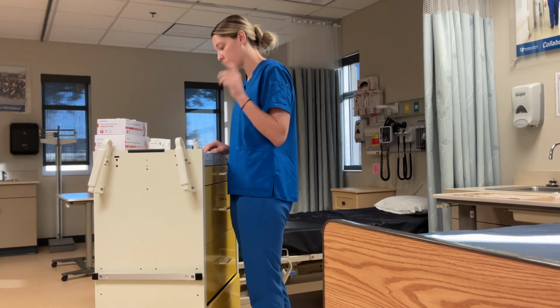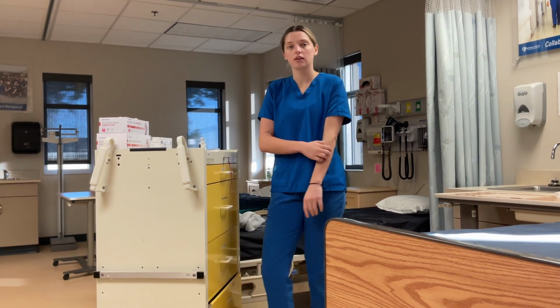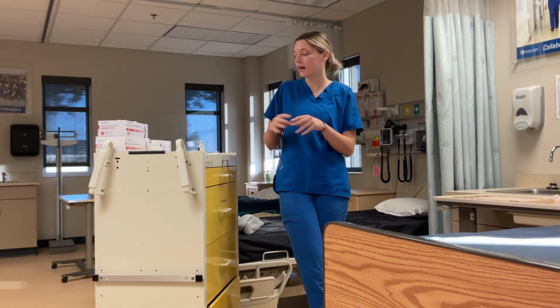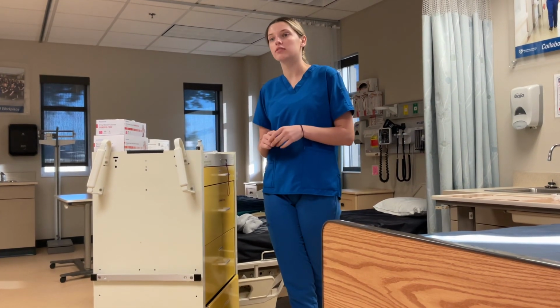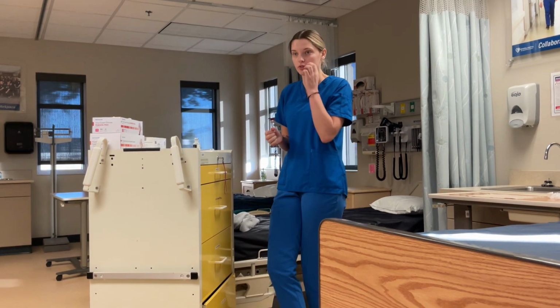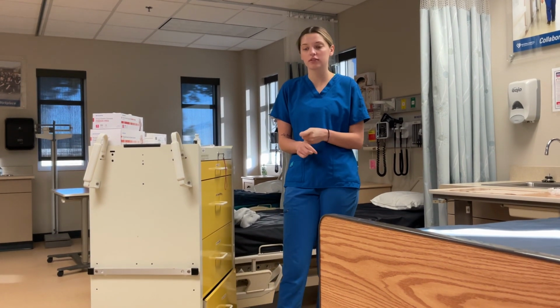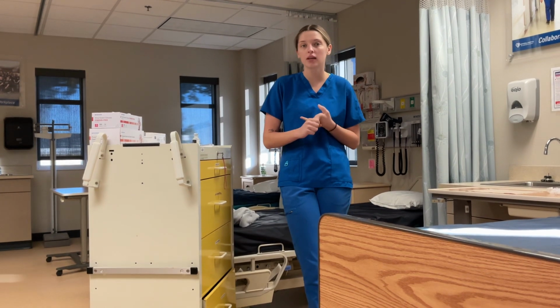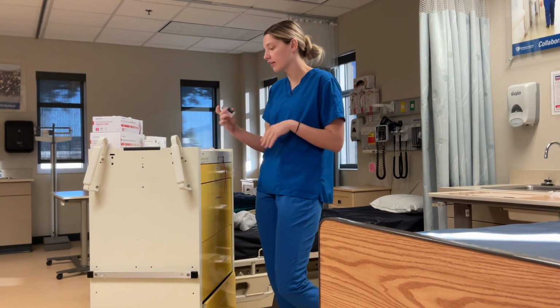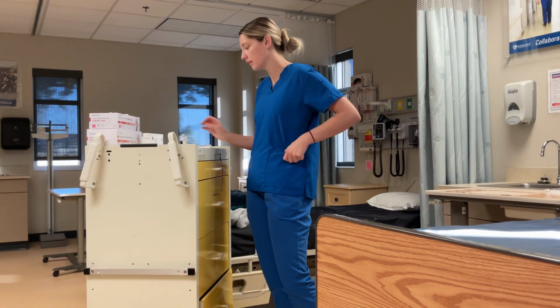So I did all my right checks, and then if it was for using a single dose vial, I would check the expiration date. For a multi-dose vial, I would check the expiration date and the date opened, as it can only be open for 28 days. If it was my first time opening a multi-dose vial, I would label it with my initials, the date and the time. I would check the integrity of the vial and make sure nothing is floating inside of the vial, so it looks good.